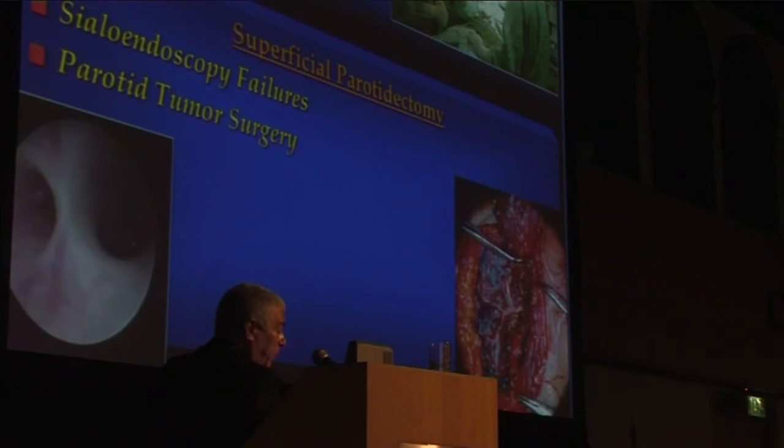And to summarize this lecture, parotid gland endoscopic surgical approach and external lithotripsy are true minimal invasive procedures. They are efficient and safe procedures. And in the future, superficial parotidectomy approach should be reserved only for sialendoscopy failures and for parotid tumor surgery.